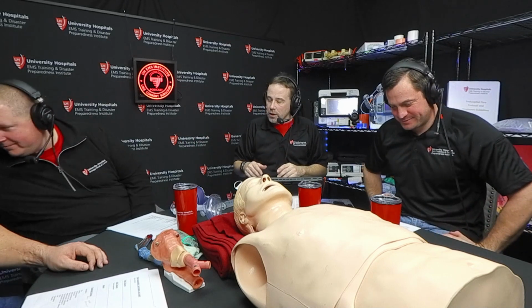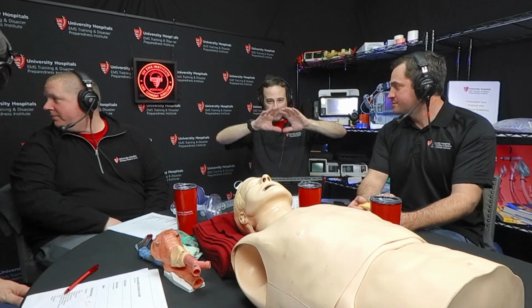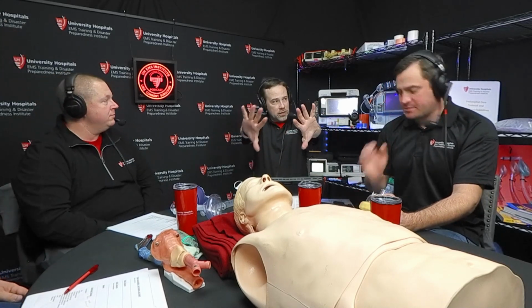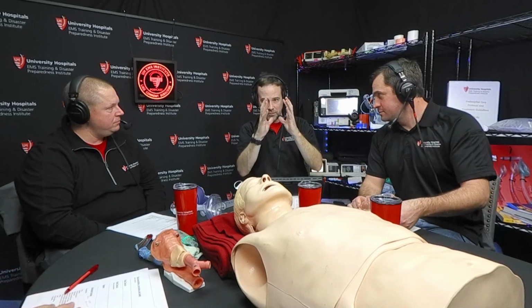But the point I wanted to make was, if you were maintaining the SATs on CPAP, which is an active process, it's just continuously pushing that air down and keeping alveoli expanded. Physiologically, you're going to do the same thing with a PEEP valve, right?